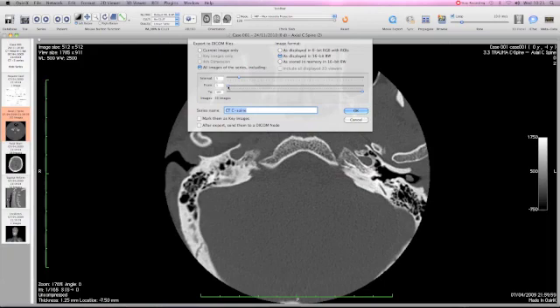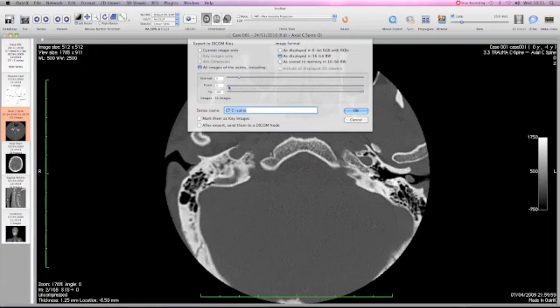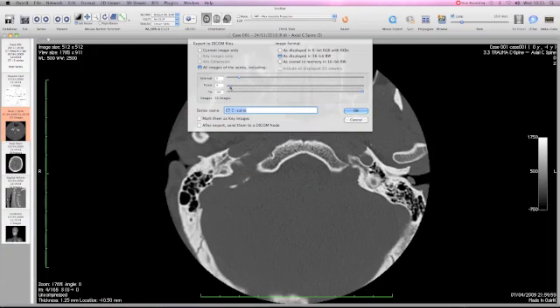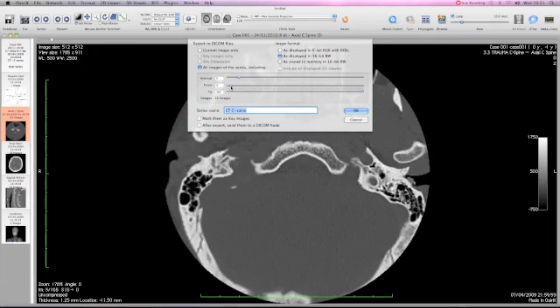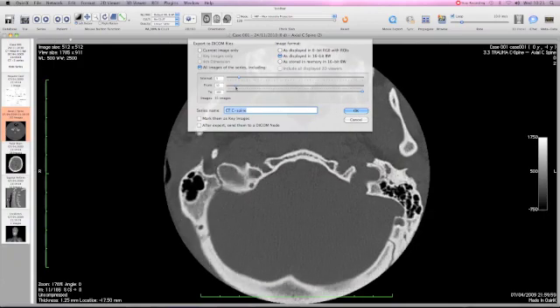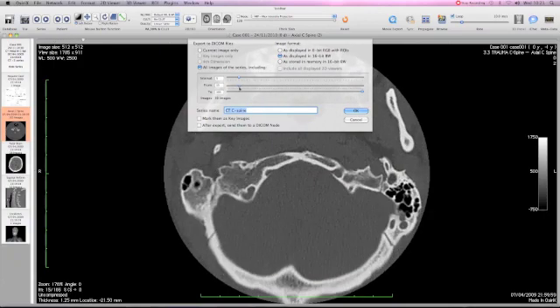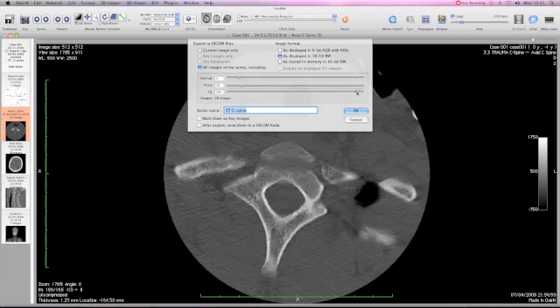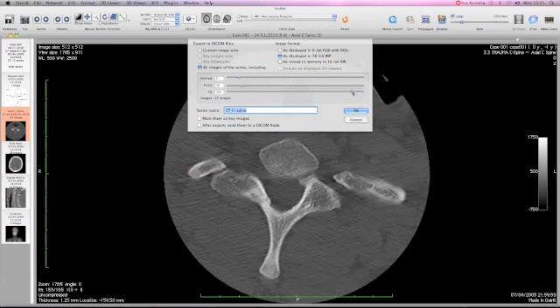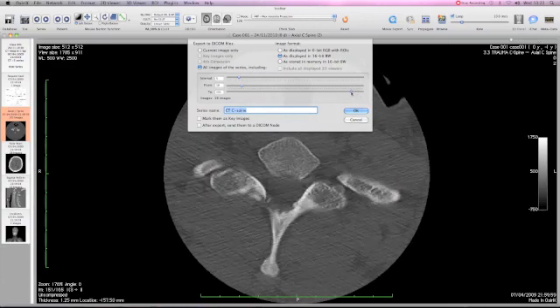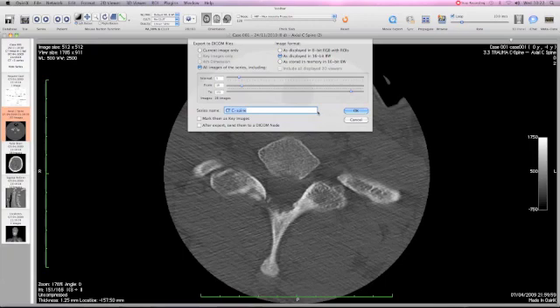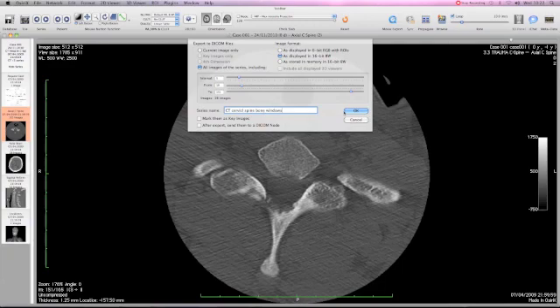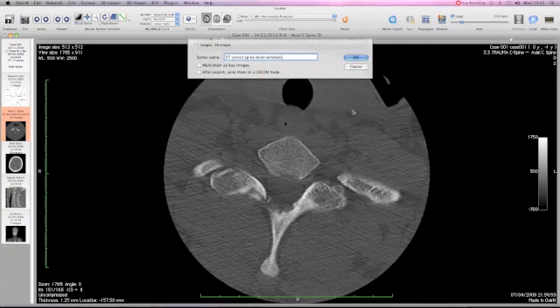The next icon refers to where we start. If there are very many redundant images at the beginning of the series, we could move this slider along to start at image 18. And the lower image could be slid backwards if there were redundant images at the bottom end that we didn't necessarily need. So having completed this, we can then name our series as we would wish. In this particular instance, we'll call it CT cervical spine bone windows. And then we'd save this data set.